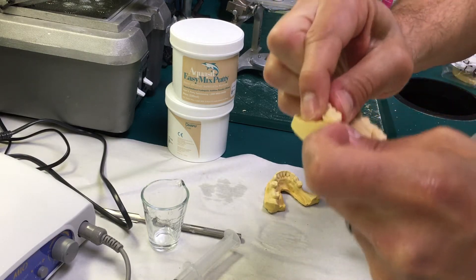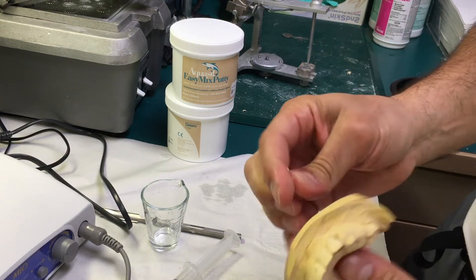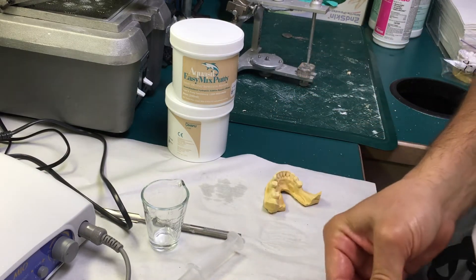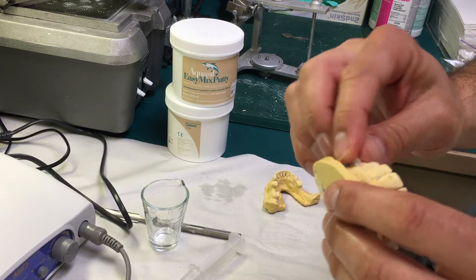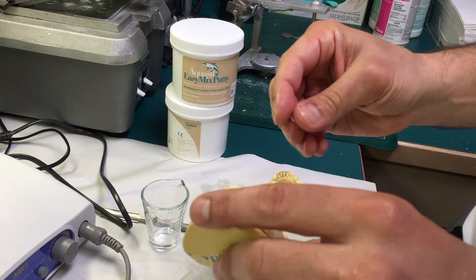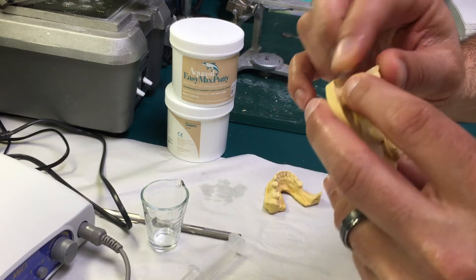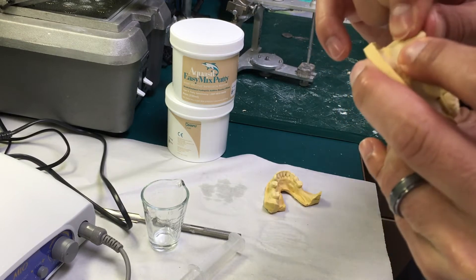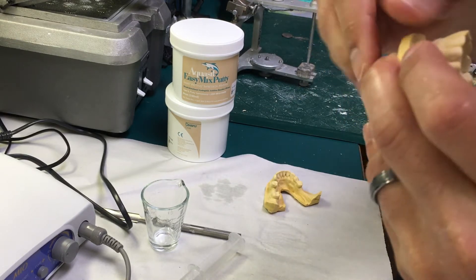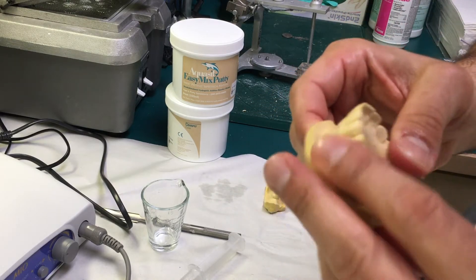I am eliminating all undercuts by basically placing wax here. Any area that you might see open where silicone may go, we don't really need that, so I'm applying wax there. That's pretty much how it's supposed to look.